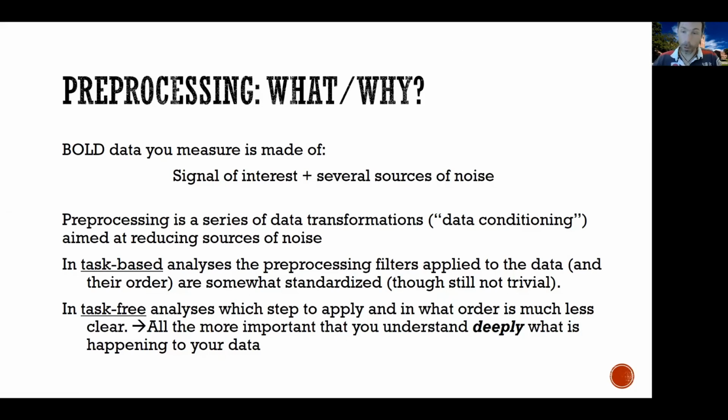Now, it's important to point out that if you're doing a task-based analysis versus a task-free analysis, the sequence of this preprocessing might be different. In fact, for task-based analysis, overall, the series of preprocessing steps and the order in which we do them tends to be fairly standardized. Still not a trivial problem, in the sense that whether the orders that we use are the best ones is still debated and they could still be optimized.